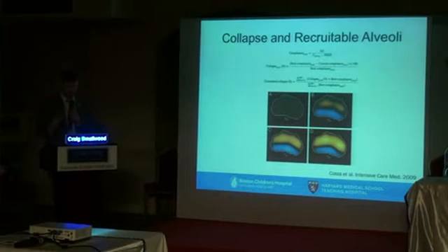So this is where the stuff starts to get a little bit exciting to me. I think a pneumothorax is a really pragmatic application. I think that'll be a really good use. But where my heart and I think my mind is really parsing is the optimization of mechanical ventilation. And really, it's a task that I think is more difficult, balancing alveolar overdistension and collapse, which happen simultaneously, as you saw in that image.